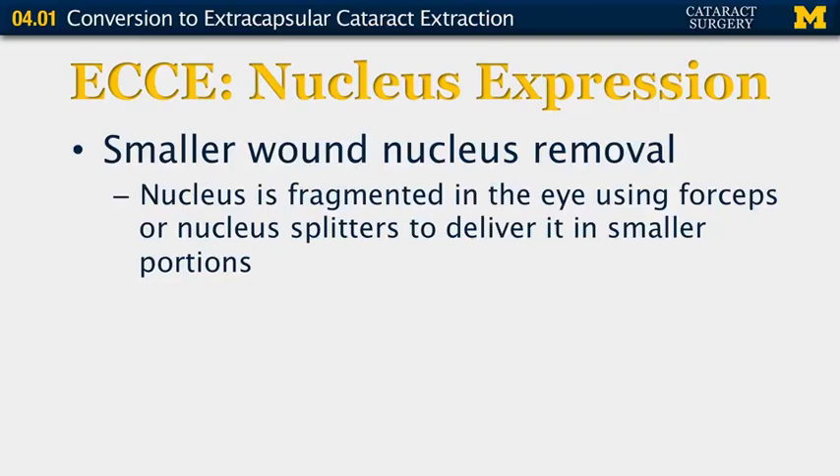There are also smaller wound nuclear removals that can be done, which will be discussed in another segment by another surgeon. You can also fragment the nucleus using forceps or a nucleus splitter and deliver it in smaller portions.